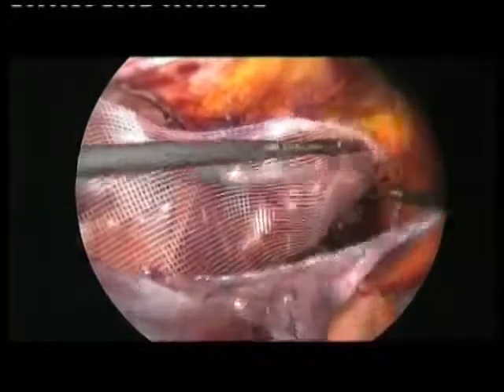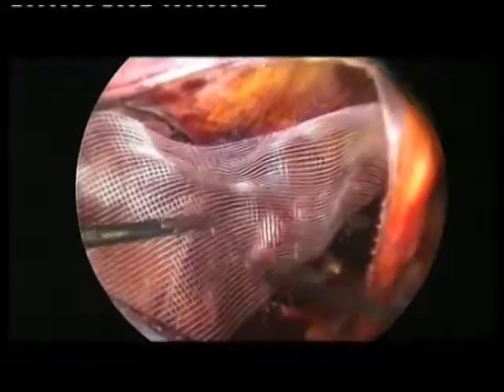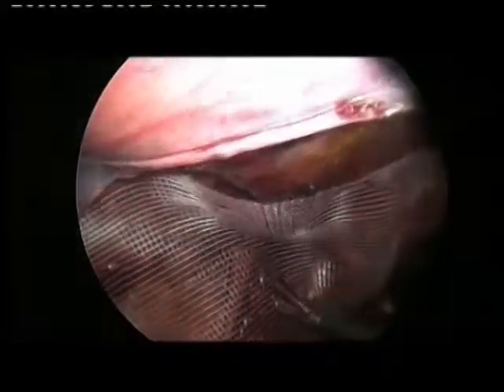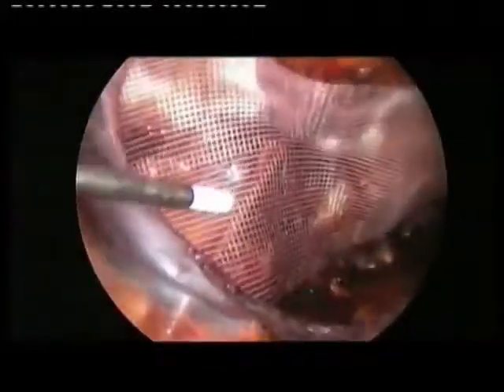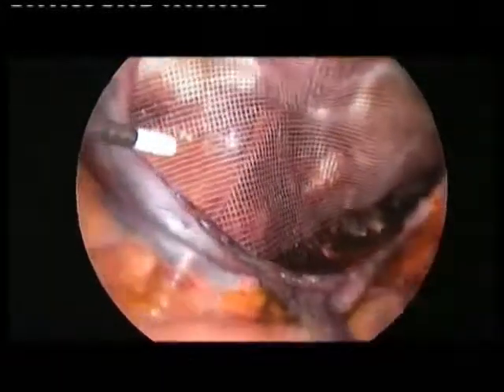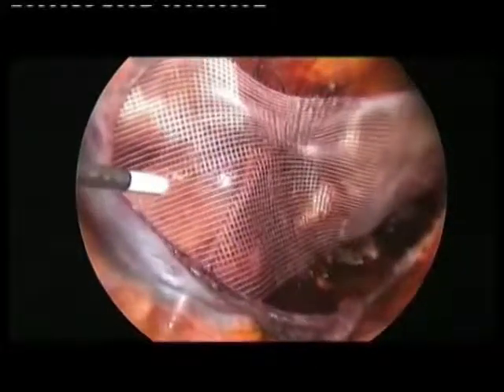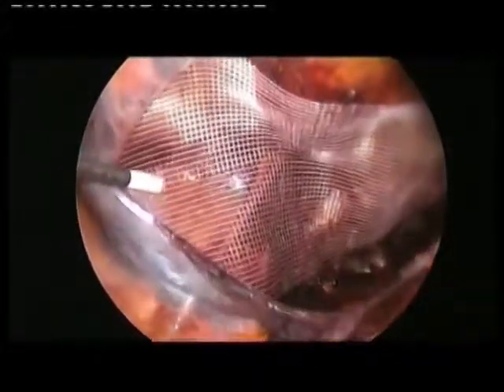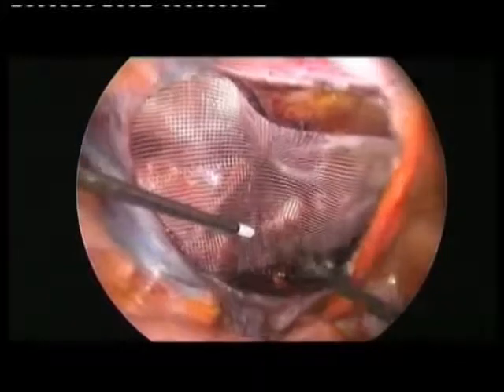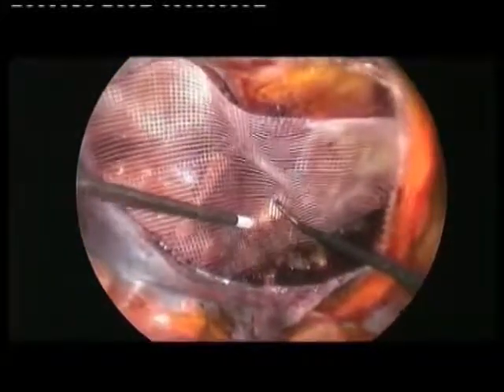With the transabdominal approach, we work in a very comfortable way. Okay. And you see here we have 4-5 centimeters below. Okay. Can I have the glue? Sometimes some surgeons don't fix the mesh. I prefer to fix the mesh. In the first part of my experience, I used clips, but with glue it is very okay. Come closer. Okay.